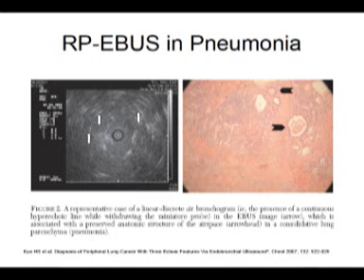Next. Conversely, this is what you see in somebody who might have a consolidated process such as a pneumonia. You see all these little linear hyperechoic things, which are actually small air bronchograms, and you're not seeing this sort of homogeneous area here with a continuous interface around it.